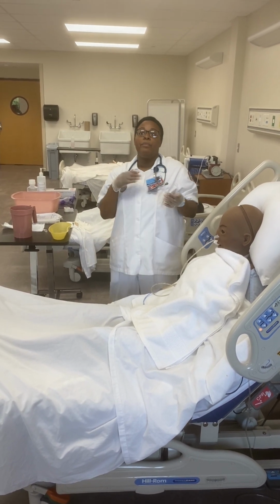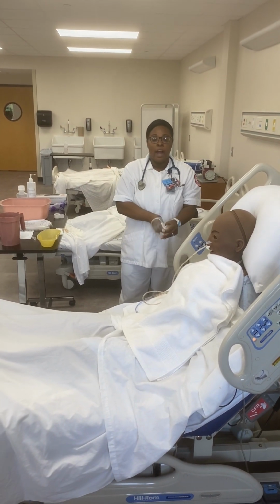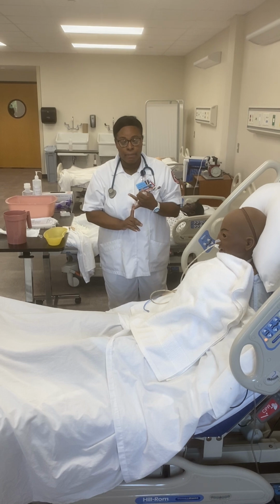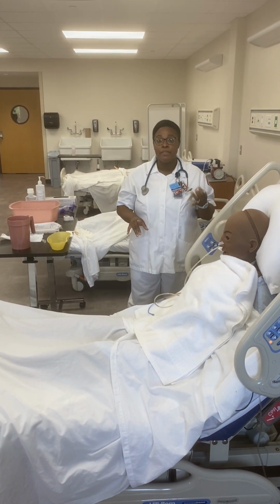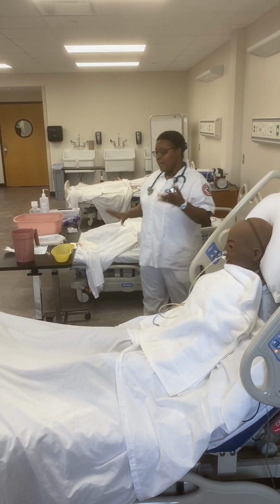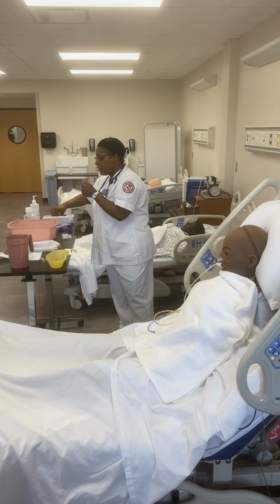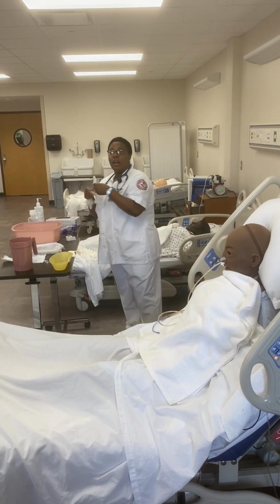Now I'm going to remove my gloves, perform hand hygiene, document the procedure, document the nostril, the naris used, the size of the tube, document the placement, document the verification of the placement and the patient's response. Now I'm going to go right into enteral feeding. Of course, I'm going to verify my physician's order, perform hand hygiene, don clean gloves, assess for allergies, identify my patient.